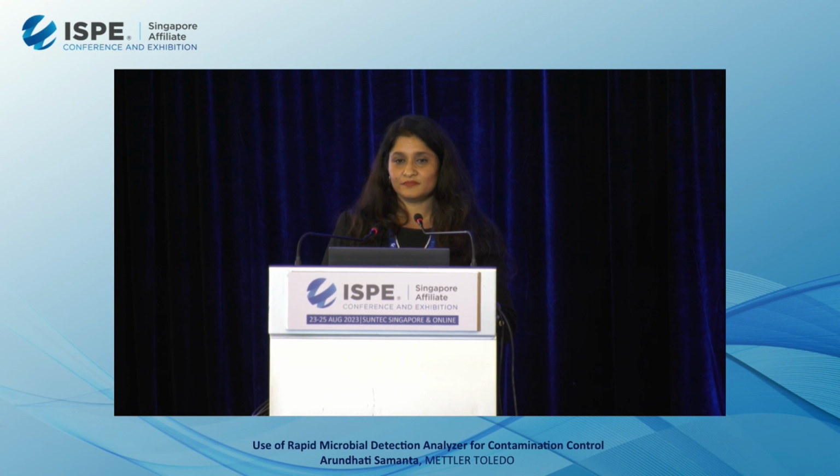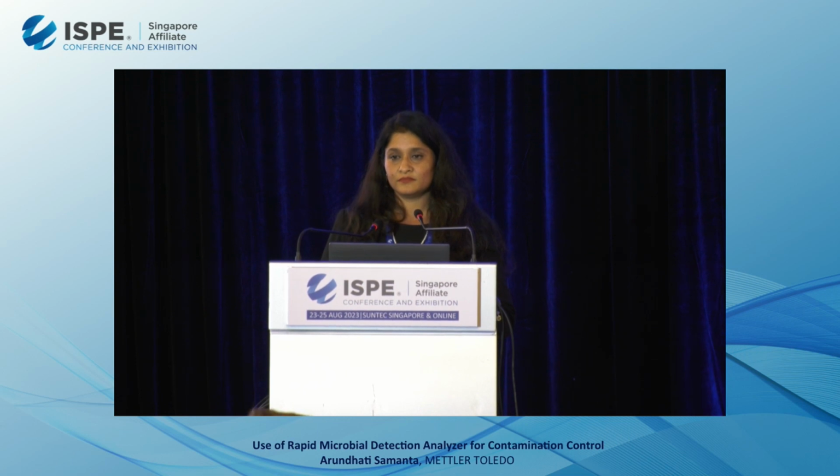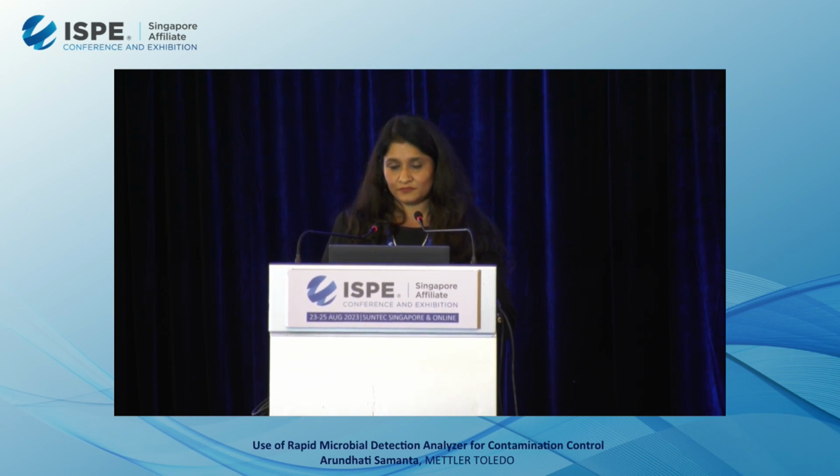I have a question. You were telling that in 100 milliliter WFI, you see 2,600 AFUs, which is quite a large number for WFI. Assuming that WFI needs to be virtually sterile, how do you correlate these WFI counts to real counts? I don't expect that this is all viable but not culturable microorganisms, because that's really what we would not like to see in this environment. So, are you expecting to have some autofluorescence molecules, particles? What is the interpretation of this count?